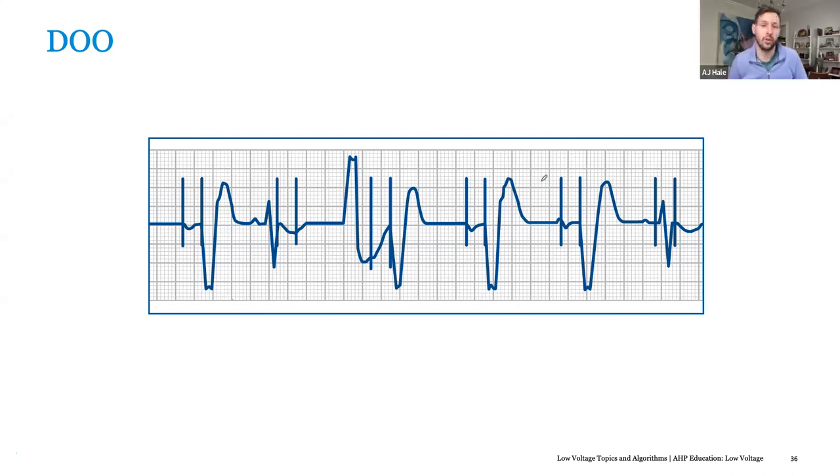That's great. So Dr. Duffy, if you haven't used it yet and you'd like to use it for a patient, I would think you'd want to, for example, in a small patient where you're worried about screwing in an active helix, or worried about forward pressure from putting in a passive fixed lead, consider this. Clinically, the advantage is you don't have to worry about an atrial perf risk. And if you're worried about them becoming occluded later in life or developing SVC syndrome, it's one less lead to take up space. So I think it definitely has its advantages.